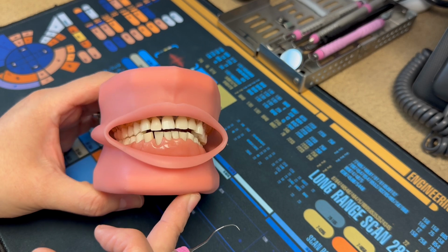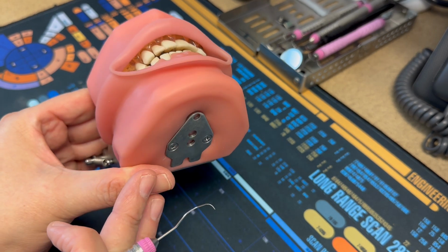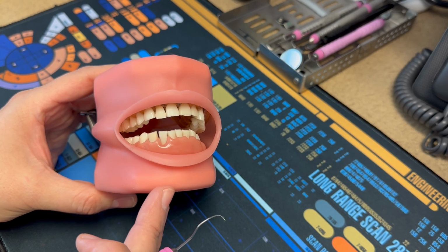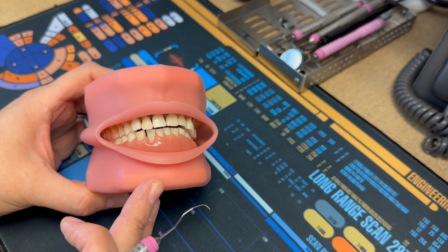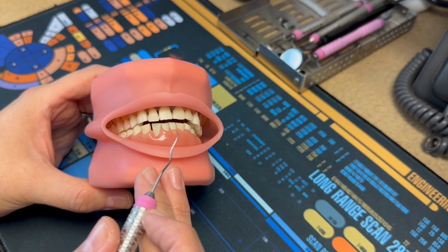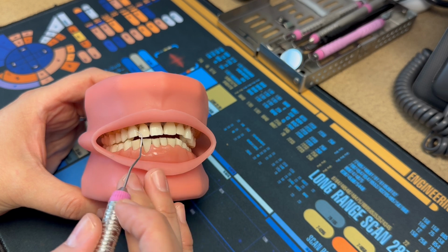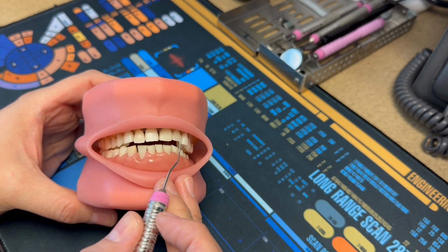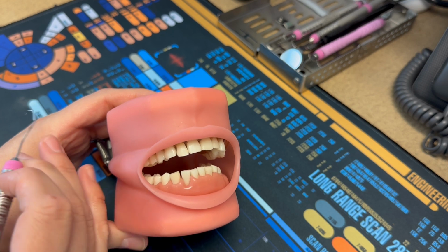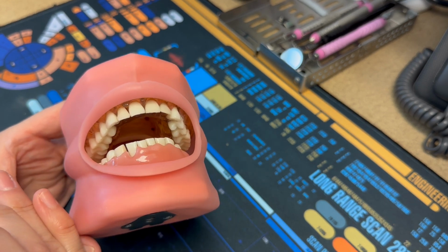Patient positioning is also a thing that you have to keep in mind, whether you're working on the maxillary, which means chin up, or mandibular, chin down. So when you're working as a right-handed clinician on surfaces towards, let's say maxillary, we're going to be sitting at the 8 or 9 o'clock. So your positioning will look similar to this. The chin will be up, okay?